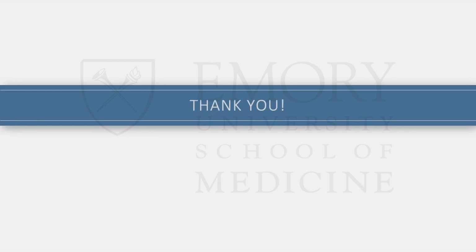And then, when it comes to saying indeterminate, I shy away from that. Sometimes I'll say it's probably abnormal, but I can't grade it. Or probably normal. I'll do my best to guide the person, not necessarily to give a disease, but it may help explain dyspnea or other symptoms. So my personal bias is to shy away from the indeterminate as much as possible, except in situations where you simply cannot evaluate, like mitral stenosis and transplant.